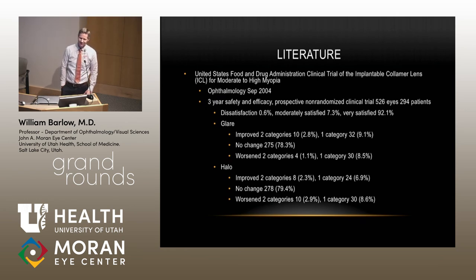The difficult thing with dysphotopsia in a phakic IOL is we still don't know the etiology. And I know that the PI is certainly something that's going to add to it. The PI is not something we have in pseudophakic dysphotopsia. In pseudophakic dysphotopsia, people have looked at many of the different etiologies: IOL material, edge design, relationship of the capsule to the edge, depth of the chamber, all of those are involved. What's interesting is that in pseudophakic dysphotopsia, the pupil doesn't do anything. You would think that it would, because it would take away any issues with the edge, but to be honest, it doesn't.